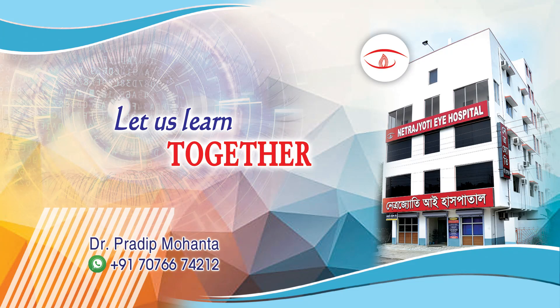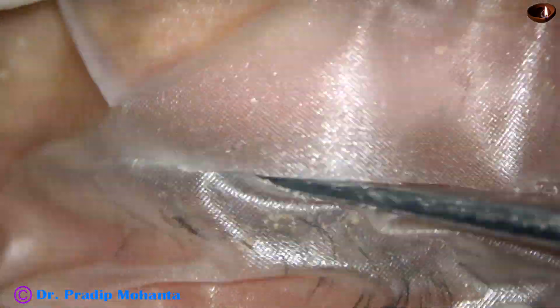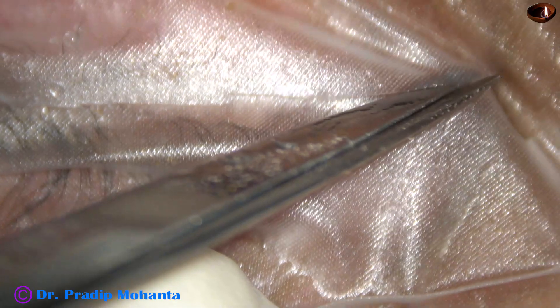Friends, welcome to my workplace at Ranaghat, West Bengal, India. In this video, I want to demonstrate intravitreal injection of vivacizumab or ranibizumab, followed by a unique way of doing paracentrasis with the help of a 26-gauge disposable needle.